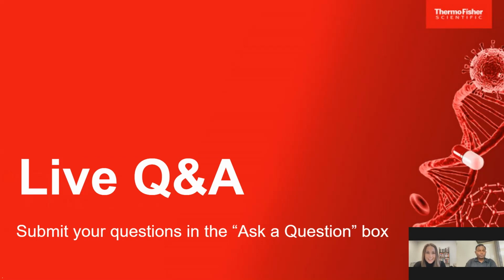Now let's get started. Our first question here: what factors should be considered when selecting the appropriate cell culture insert for a specific experiment? Okay, thank you for the question. Typically when you design an experiment, you will be choosing a particular type of cell. So that will be your first factor. It depends on what type of cell you use. You can choose the kind of dish you want to use.